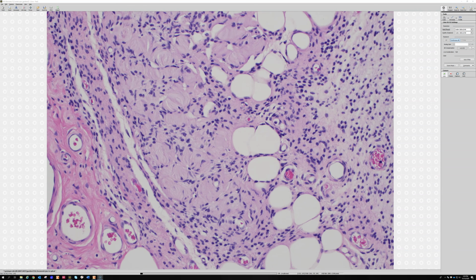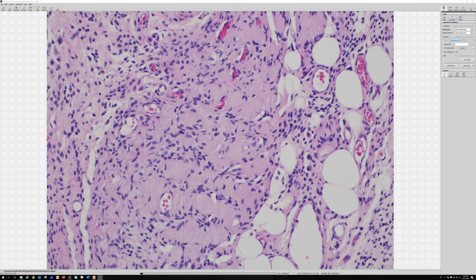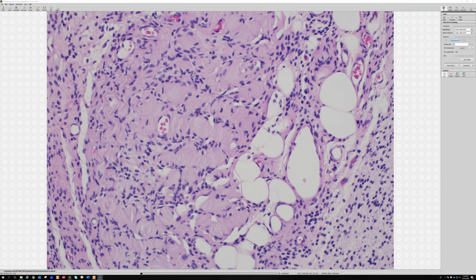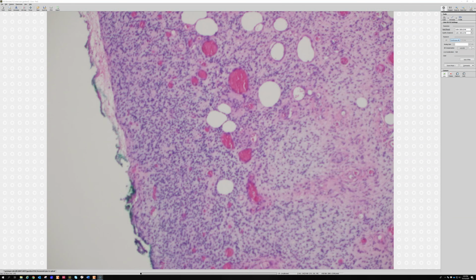And again, if you just take one of these, it very closely recapitulates what you see in a Meissner's corpuscle in the skin, in the papillary dermis. So when you find those, that's a nice clue for the diffuse type of neurofibroma. They often have those, not always though. That's a pretty robust example.